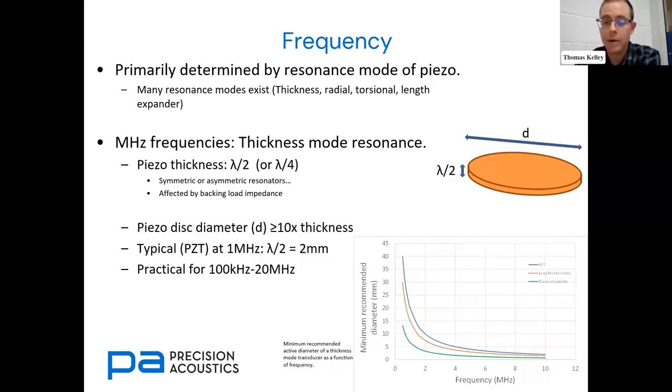But if we had a low element count, for example, if it was only 4 or 8 elements, then it's a little impractical, but it's still within the realms of possibility for acquiring 4 or 8 discrete laboratory amplifiers and sending the signal to each of them and controlling the inputs to the amplifiers through some sort of software means. But if you're looking at high element count arrays, then that approach becomes a lot more impractical. If that helps to answer the question.